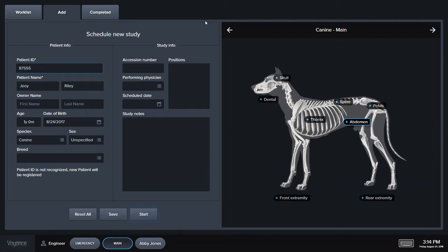Today I will be demonstrating how to use the software to easily take, edit, and share x-rays. To start, I'm on a new study page where you can input the patient ID, name, and any other information such as the species and the breed of the patient.